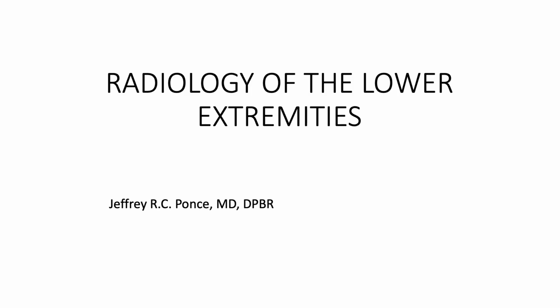So, for this session, we will tackle lower extremities. The consideration again is that we request X-rays according to the regional anatomy of the lower extremity.